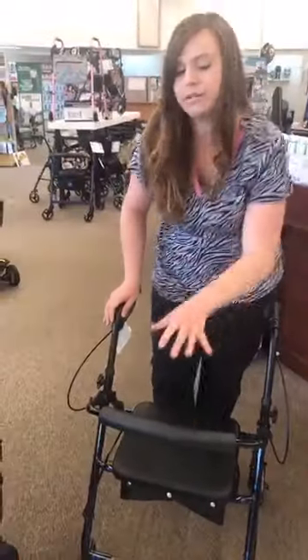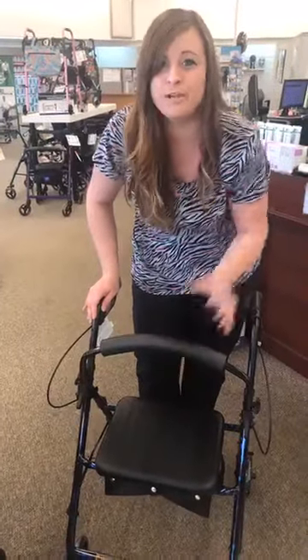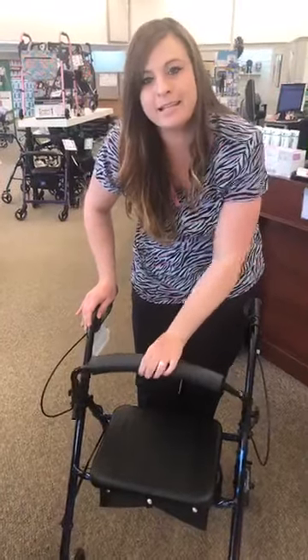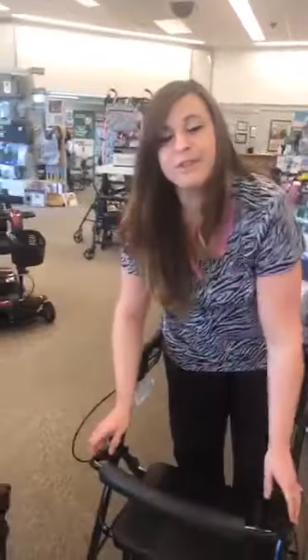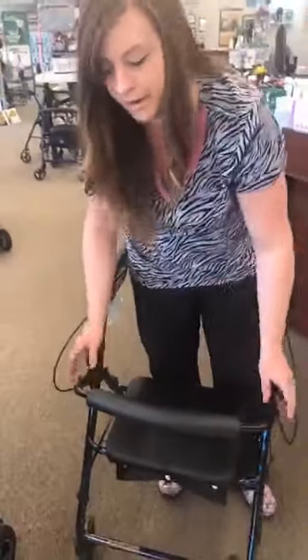Another thing I want to show you guys, and this is mainly just for storage. You don't ever want to take your backrest off and leave it off. But if you guys are needing to store it, if you're going on a trip, you need more space in your trunk, most of these have a removable backrest. The biggest thing is just remember to put it back on before you actually start using it. Of course, if you don't have your backrest on there, you risk falling backwards when you sit on it if you forget it's not there.